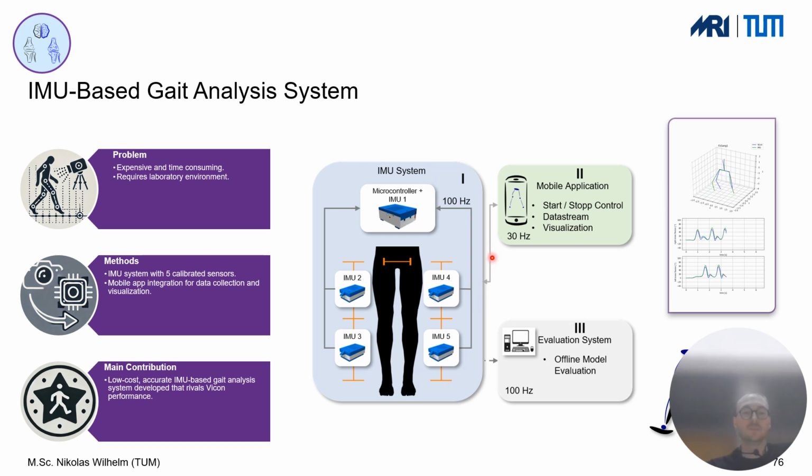Here the main idea was to simply use a mobile application where we can then go through different stages of calibration and then also the visualization and data collection at once. So here I would recommend to use a headless system, and just a simple LED was used to display for each of the IMUs if they are properly working and happy with what they're doing.